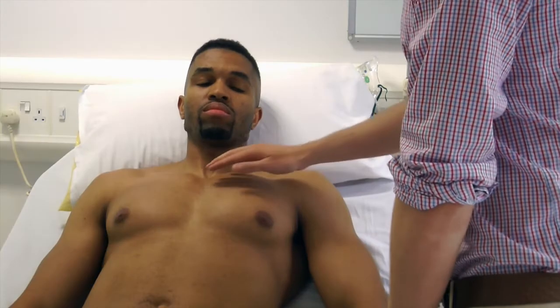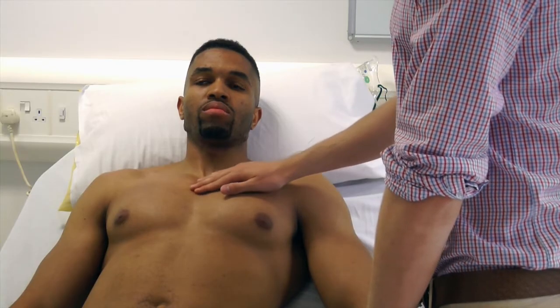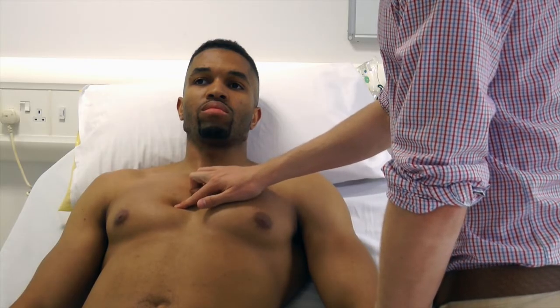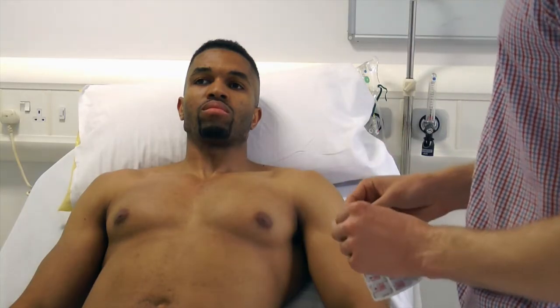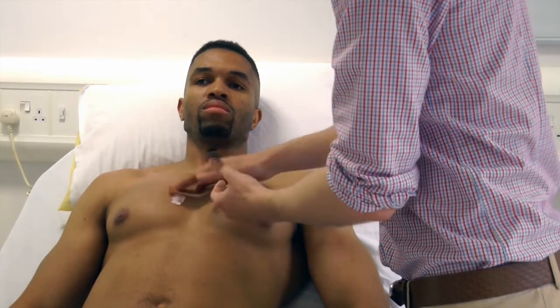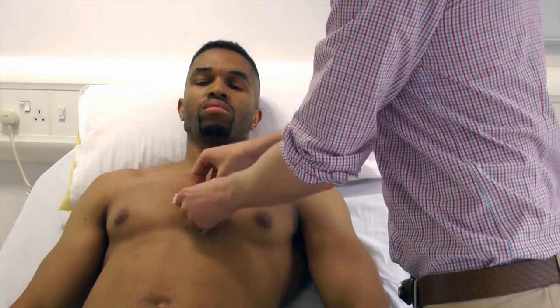Chest lead V1 is located on the 4th intercostal space on the right sternal edge. Palpate the angle of Louis and then move sideways to palpate the 2nd, 3rd, and 4th intercostal space. Place chest lead V1 on the right of the sternum and chest lead V2 on the left of the sternum. Ensure the attachment area is facing downwards so it is in the correct position for attaching the leads.